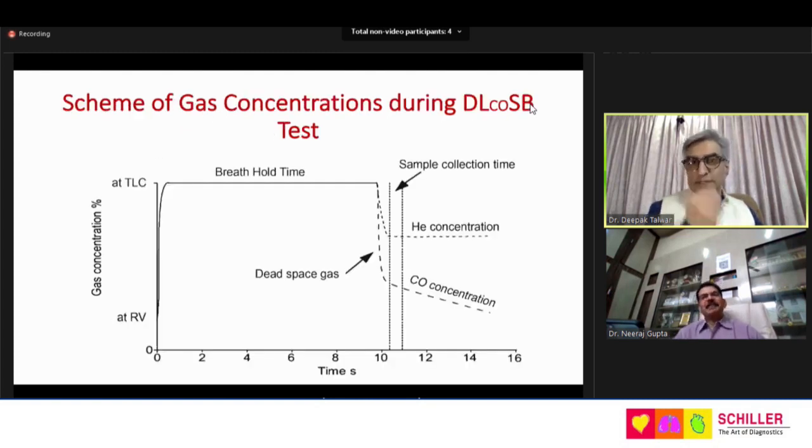Now this is what the entire process is. You can see that the person inhales from the residual volume. Once the person is tidal volume breathing, he exhales out to the residual volume, and then takes a breath in which the gas gets into the lungs as quickly as possible. That's true, but it doesn't need to be a forced inspiratory procedure. It's like slowly filling. Otherwise, you'll have a back pressure or increased pressure, which will collapse the alveoli. I'll tell you about this a little later.